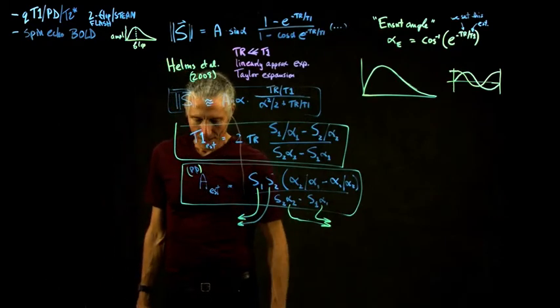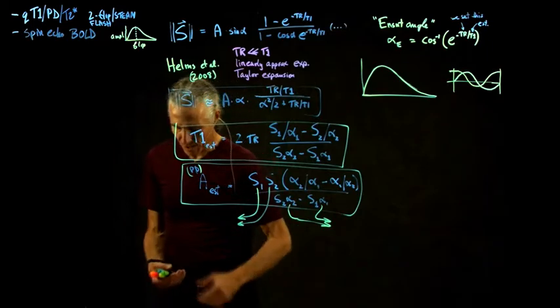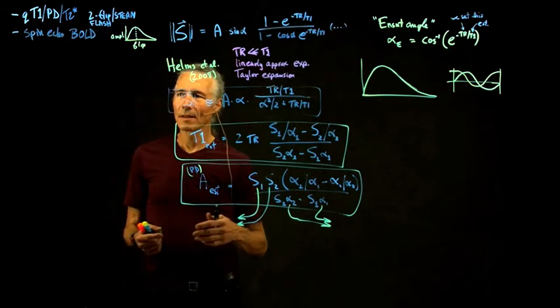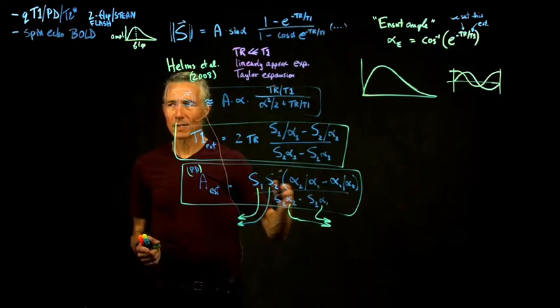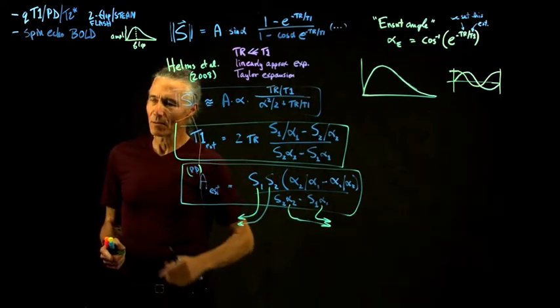The pulse sequence is pretty much just a standard FLASH. As opposed to MP2RAGE, where you did 1 inversion and then 2 whole collections of K-space at 2 different inversion times, this one is just a regular old FLASH.